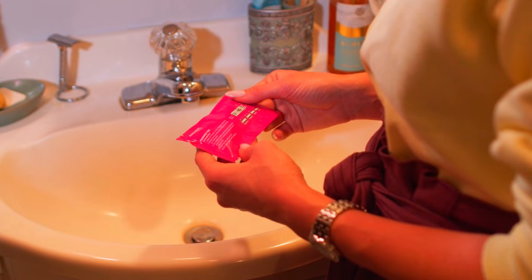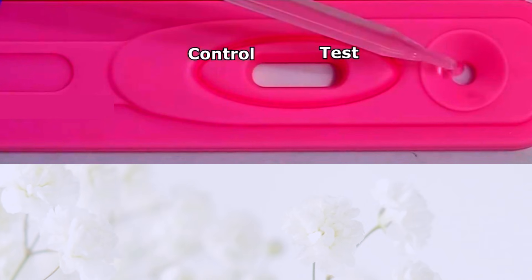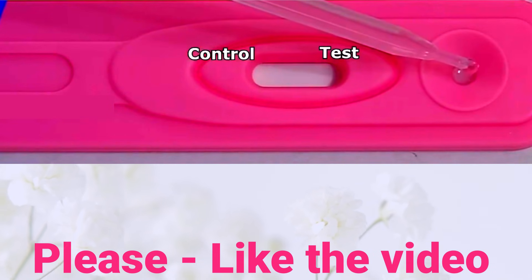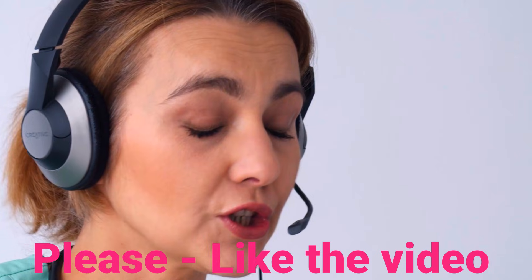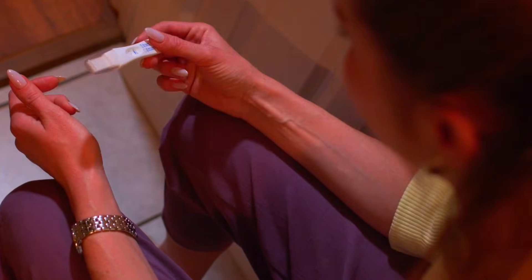Hello, today I will show you how to do a simple home pregnancy test, and I'll also share some super important tips and tell you the common mistakes almost everyone makes when taking the test. This is super easy, so don't worry. Even if you've never done it before, I'll guide you step by step. Let's get started.